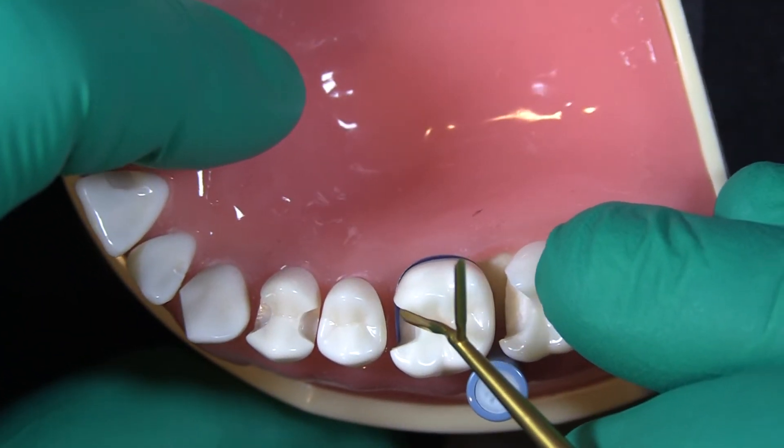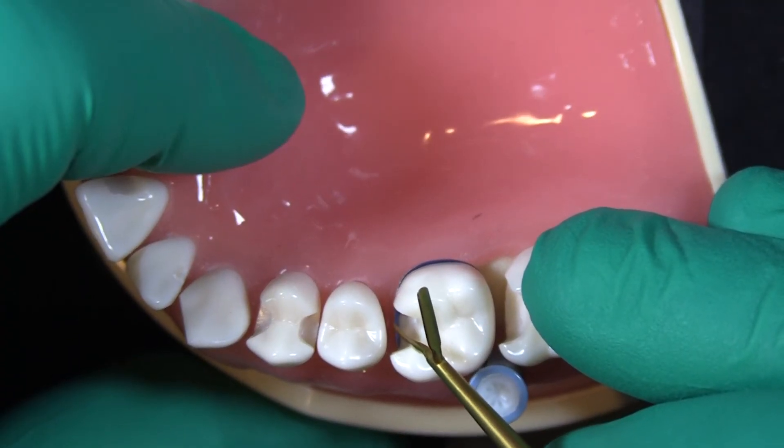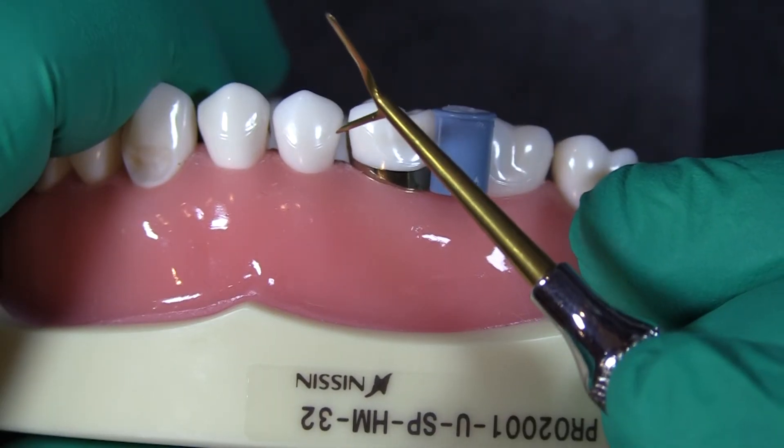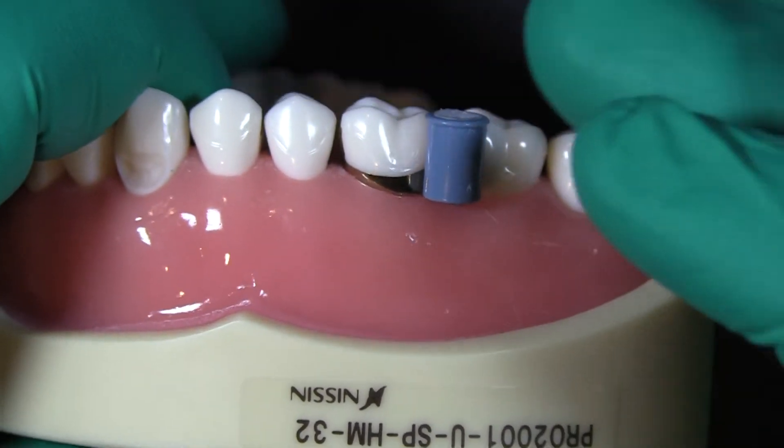The goal here is to build up this restoration right about to that point before we can start bringing it out to shape our interproximal contour.